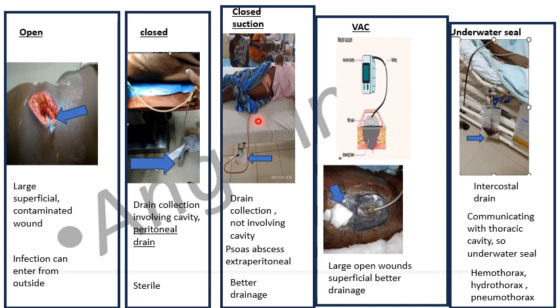This suction drain, again, I'll be taking you through some other scenarios where you will be using a suction drain, like your post-thyroid surgery or your incisional hernia surgery. These are the common ones, and breast.